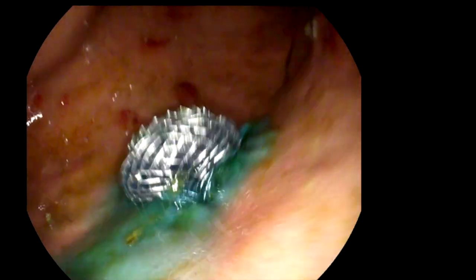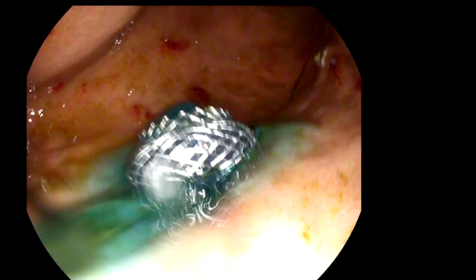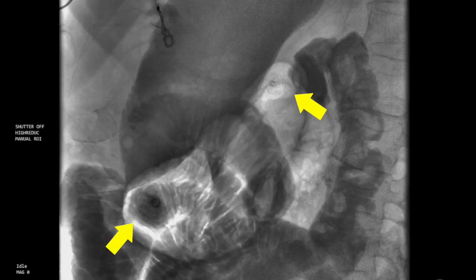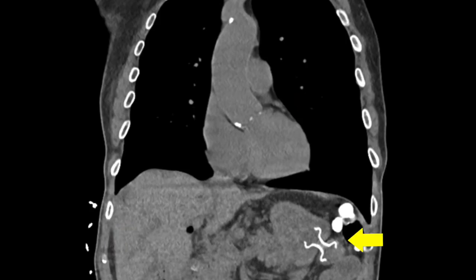At the end of the procedure, the position of the choledochoduodenostomy stent and the gastrojejunostomy stent was confirmed on fluoroscopy and via endoscopy. CT performed 24 hours after the procedure confirmed the correct position of the gastrojejunostomy stent.